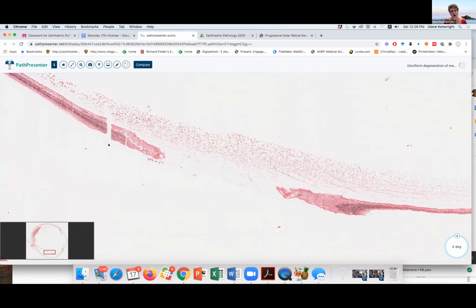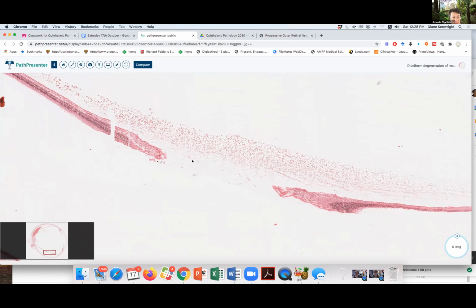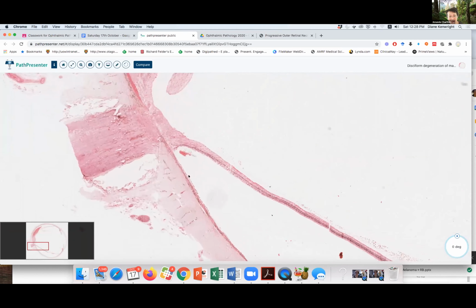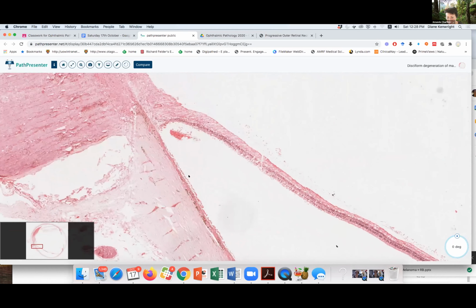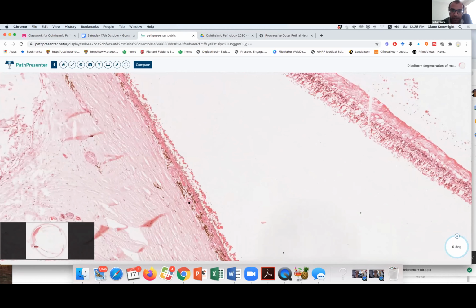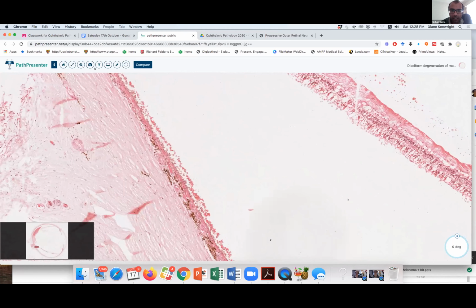The retinal hole, I think this might be artifactual, because it's curving away and down. It's probably just not in the section rather than a real retinal hole. So Jess thought there might be some on the inferior retina. Are we in the right place? Posterior or anterior to the equator? I thought it was posterior to the equator in the inferior. So if you keep going down.